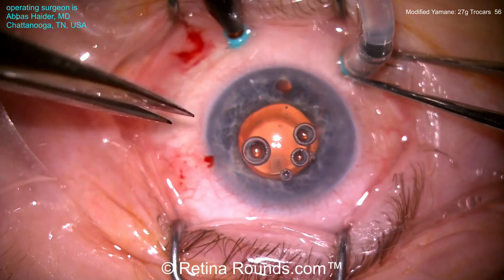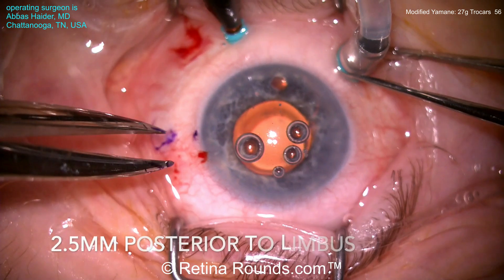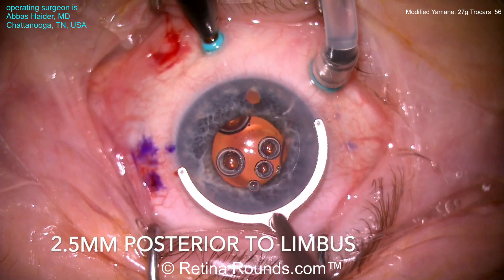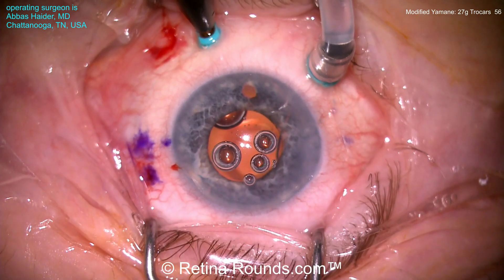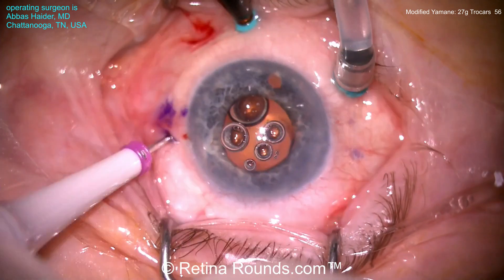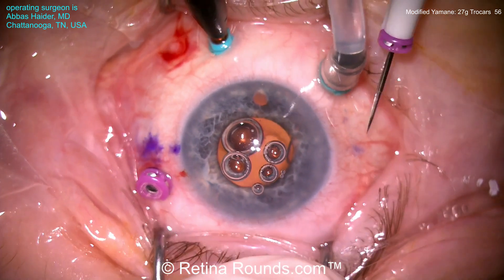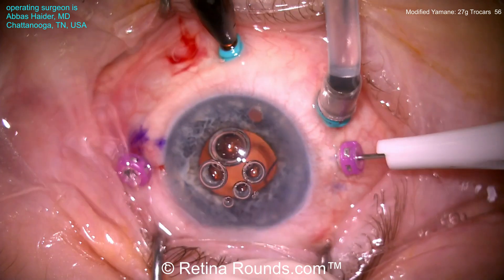Now in the infratemporal quadrant, the infusion line trocar is placed. We've slowed down the video so you can see these steps. Dr. Haider is marking where he's going to be placing his trocars — two and a half millimeters posterior to the limbus. Then using a toric marker, he's going 180 degrees to the opposite side and making a mark for the second trocar placement. A 27-gauge trocar is being placed in much the same fashion as for a vitrectomy, but oriented in the direction he wants to externalize the haptics.